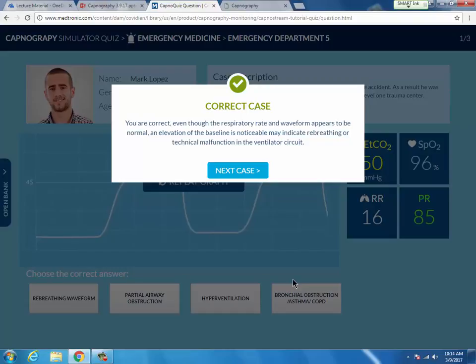For whatever reason, folks thought that was a good idea for hyperventilation. Also, the same premise as a non-rebreather mask has the one-way valve so that you don't breathe that CO2 back in, all right? And so, again, what is significant about that is that that sampling tube is still picking up CO2 as I'm breathing in. Does that make sense? When it really should be picking up no CO2 as I'm breathing in. So what that's telling me is that that CO2 is just cycling, breathing it in, breathing it out, breathing it in, breathing it out. Okay?